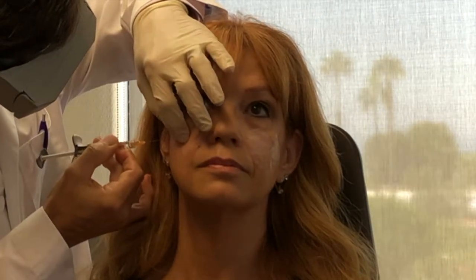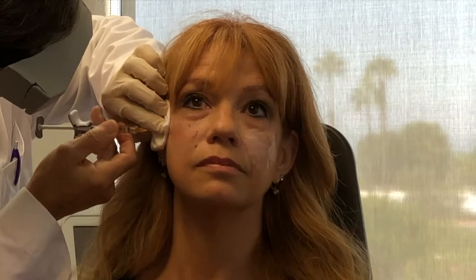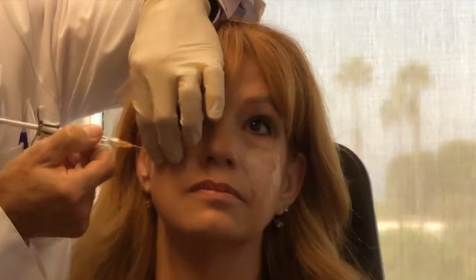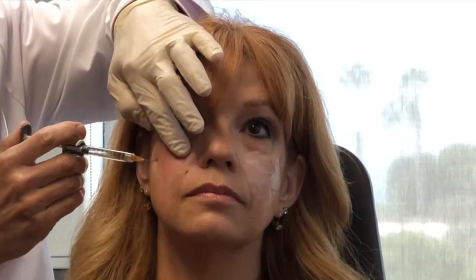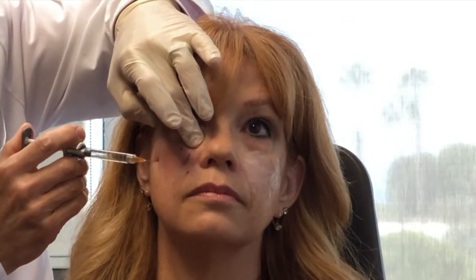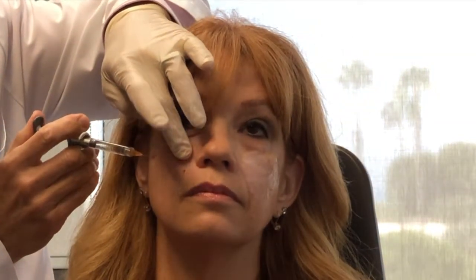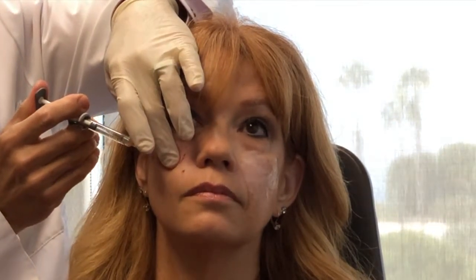We are now going to come in from our lateral port into the cheek using our 25 gauge needle. I find it beneficial to pinch and raise that skin, and you will feel a discreet pop into the space where you want that filler to go. Once that pop takes place, I always aspirate back. That is not a guarantee that you are not in a vessel, but it is very much a safe maneuver and helps us gauge where our filler is being placed.